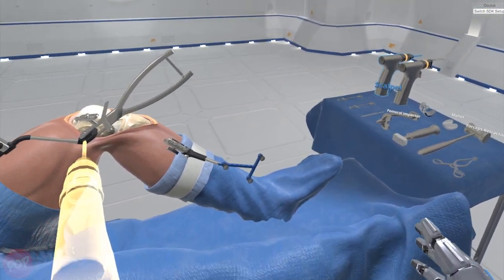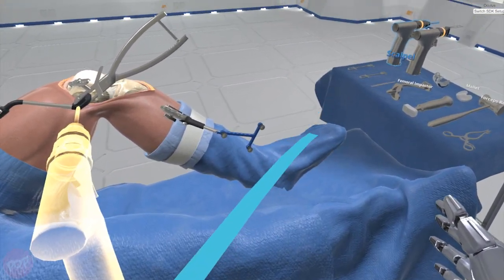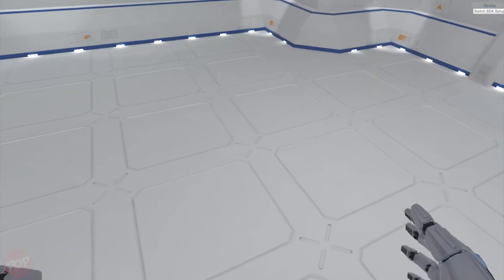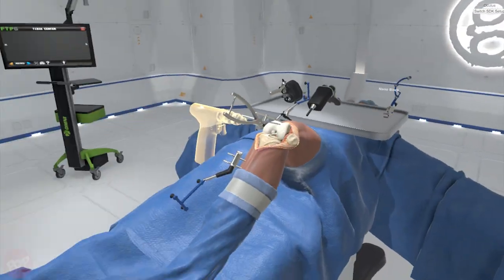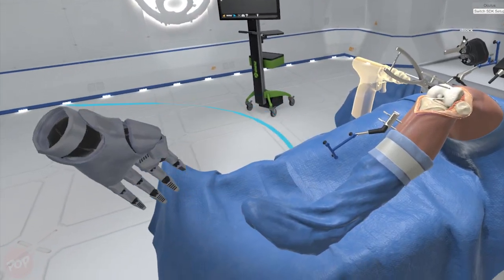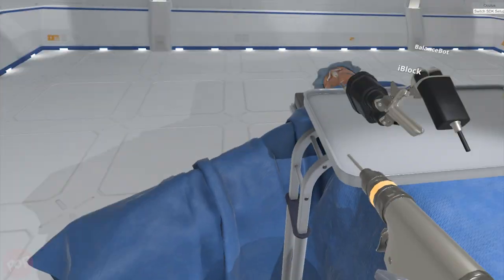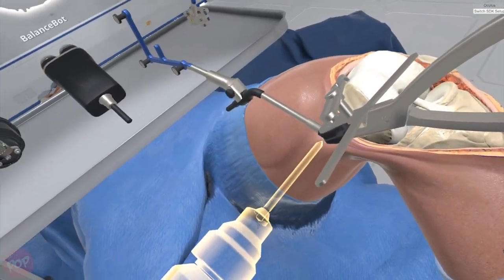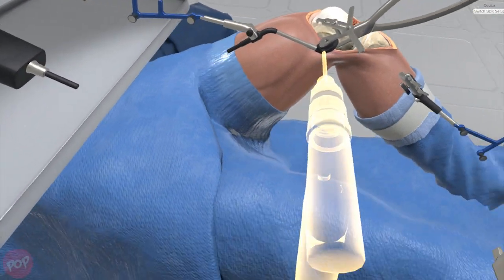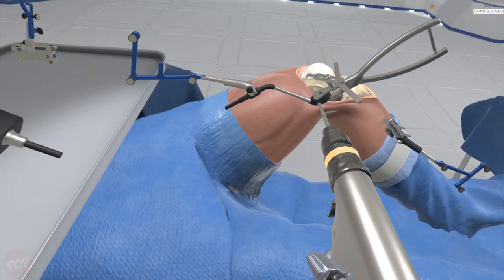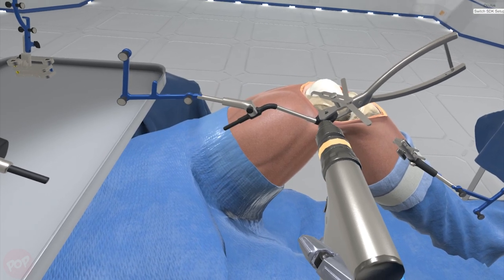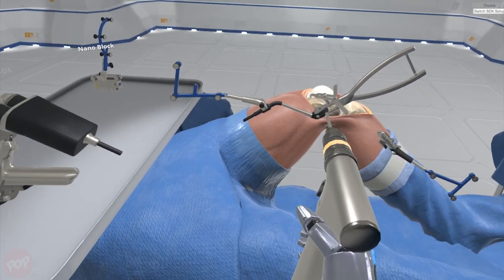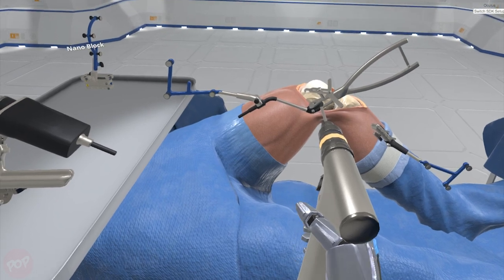Two anchor pins are required to anchor the fixation base. Grab the pin driver. Pull the trigger to install the first anchor pin, securing the femoral array to the medial cortex of the distal femur. Pull the trigger to install the second anchor pin.